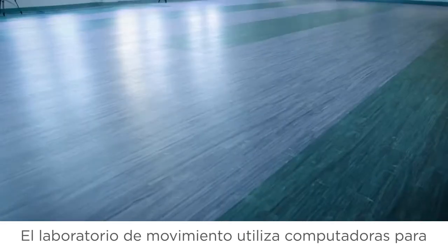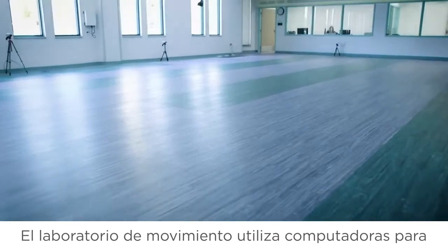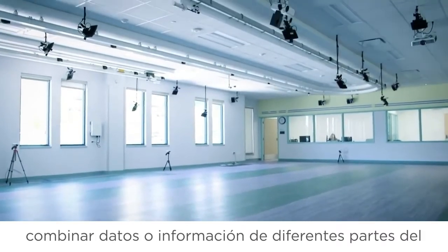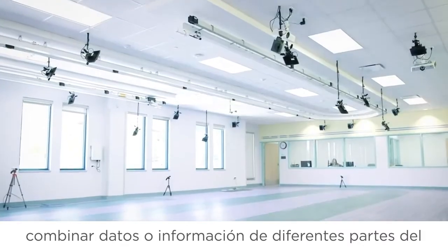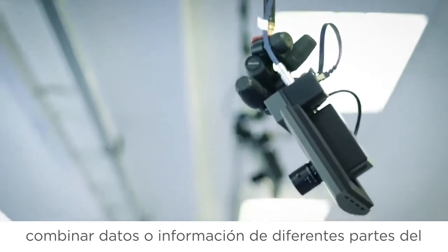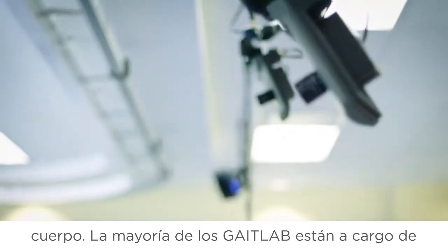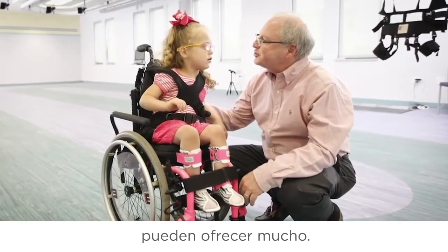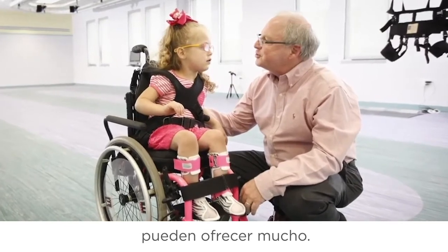The motion lab uses a computer to combine data or information from different body parts. Most gait labs are directed by orthopedists. Because I've always had this interest, especially in upper extremity function, I just thought there was so much more these labs can do.